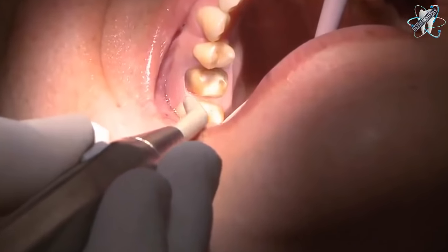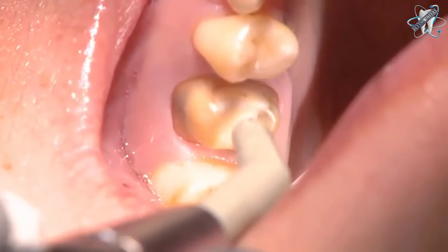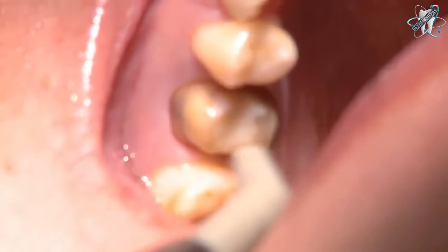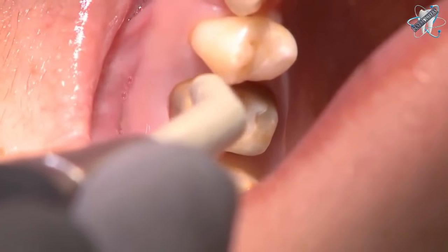The following tooth is a subgingival preparation. As seen in this case, the tissue is healthy. If bleeding is present or encountered, apply a hemostatic agent prior to placing the retraction cords.